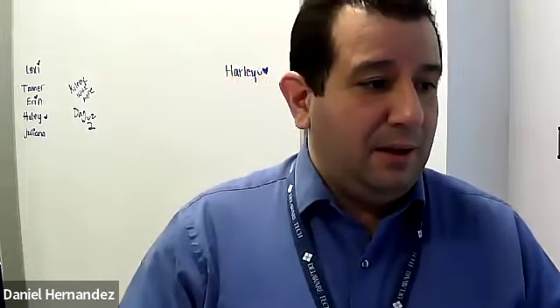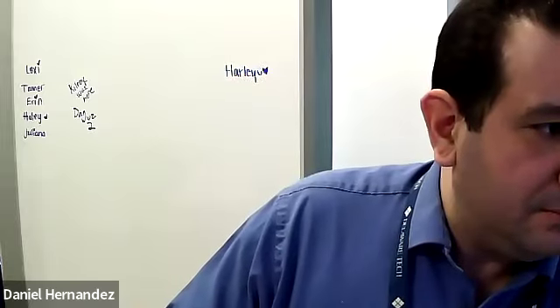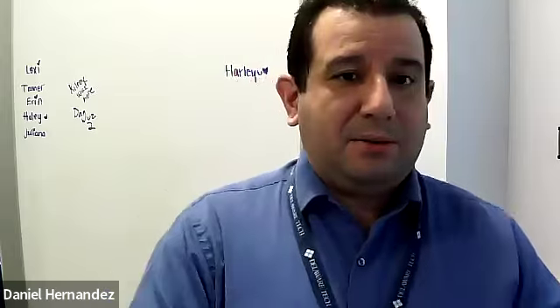If you're lucky, you can visualize the appendix kind of draped over the iliac vessels, so it can be seen anterior and medial to the psoas muscle and then lateral to the iliac vessels. Again, like I was saying, when we're scanning the patients, ask the patient to point with one finger to where they're experiencing most of their pain.